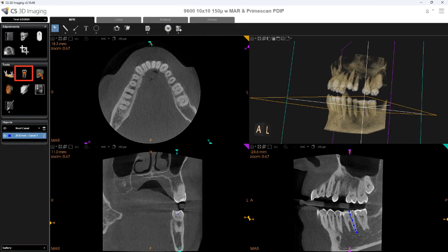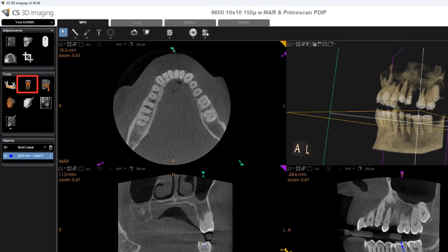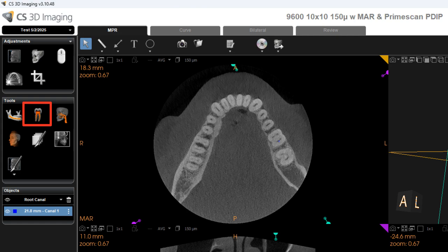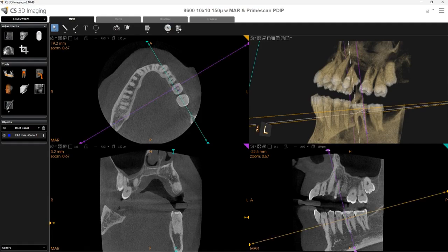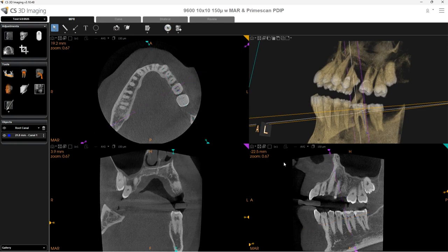If you are tracing a tooth with multiple canals, select Draw Root Canal again and repeat the previous steps for each additional canal. You can adjust the planes as needed for better visibility, and you can use any of the MPR view screens to assist with the tracing process.